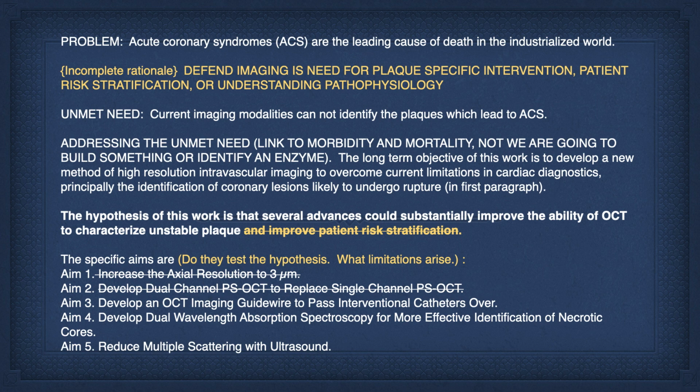But if you can keep the guide wire with its imaging system in place and pass interventional devices over it, then that's a huge advance. And in the field, developing dual wavelength absorption spectroscopy for more effective identification of necrotic cores.